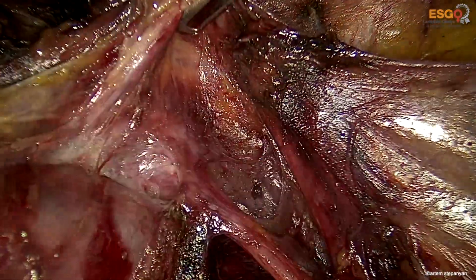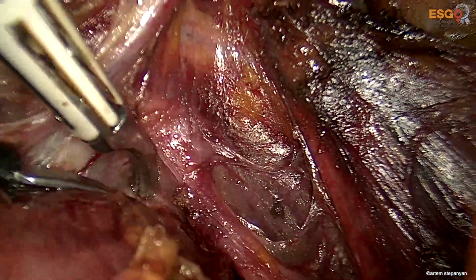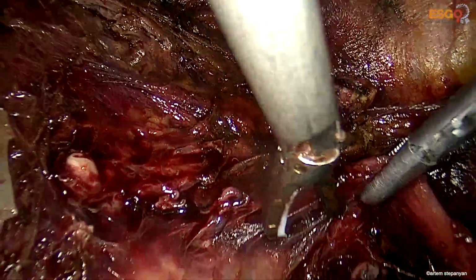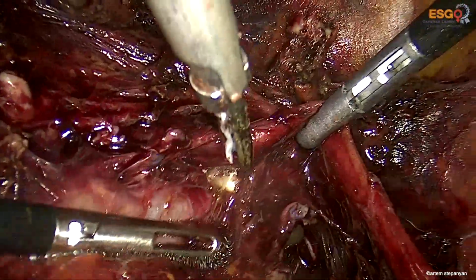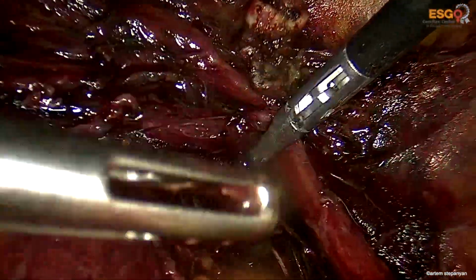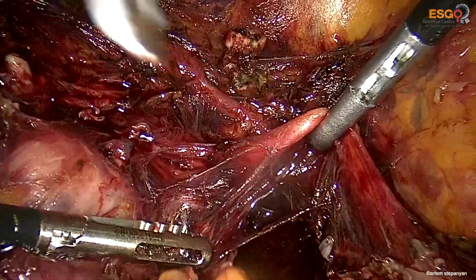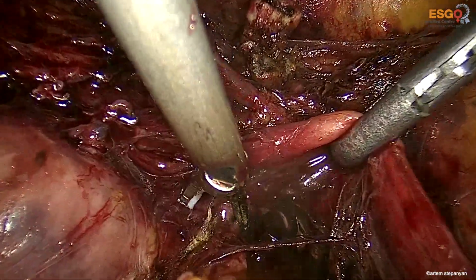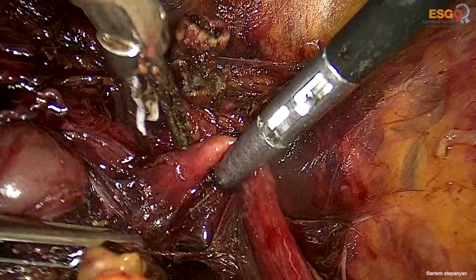the ureter is a bit attached to the tumor, to the infiltrated posterior leaf of the broad ligament, so that we are trying to isolate the distal ureter to be able to remove the pelvic peritoneum with the tumor in one block without destroying the integrity of the tumor conglomerate located just behind the uterus.